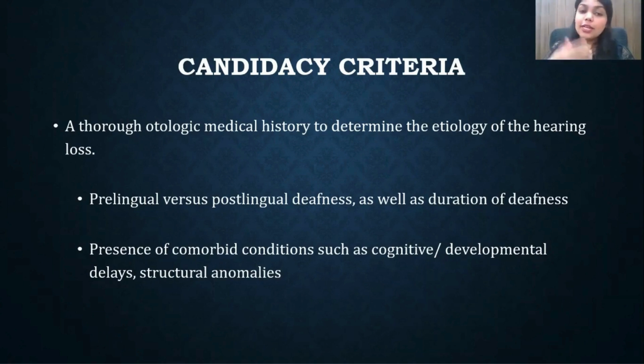We also should take into consideration the duration of deafness, because it is directly proportional to the auditory deprivation which the person has gone through, which can affect the outcomes of a cochlear implant. And the presence of comorbid conditions such as cognitive disorders, developmental delays or structural anomalies also should be taken into consideration.